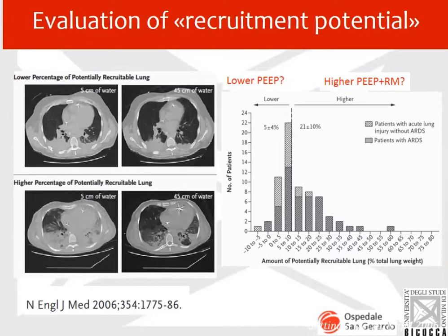And indeed what they have shown is that there is a large spectrum concerning the amount of lung which can be reopened by positive pressure.